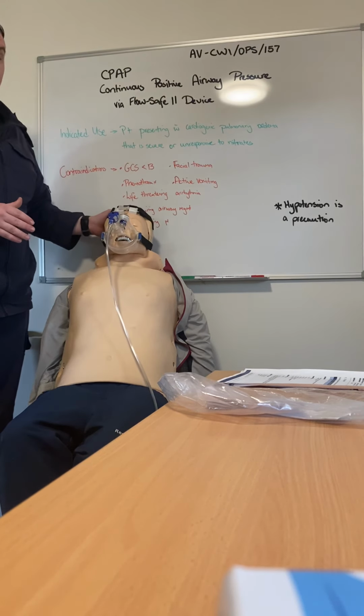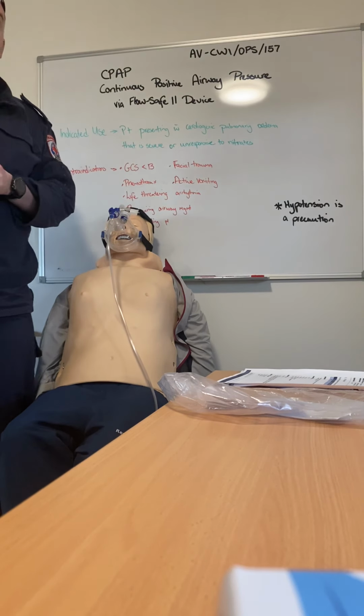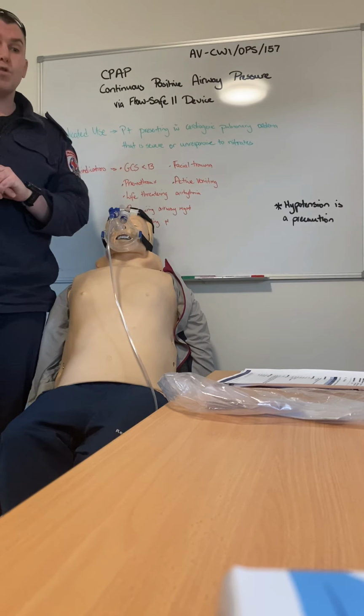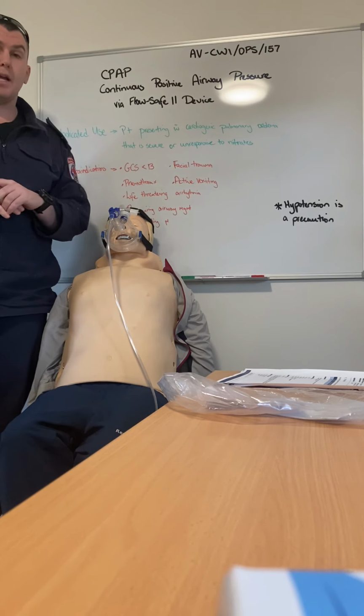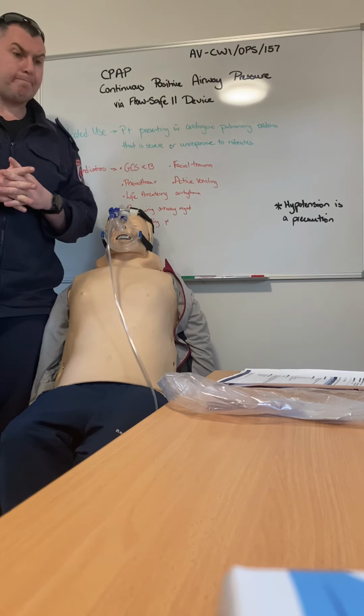And this should be everything you need to do. There are lots of things that need to be looked at, and constant monitoring of the patient afterwards. There are indications for removal, particularly if the patient's GCS score drops, or the patient becomes agitated or non-compliant. A lot of it comes down to paramedic discretion.